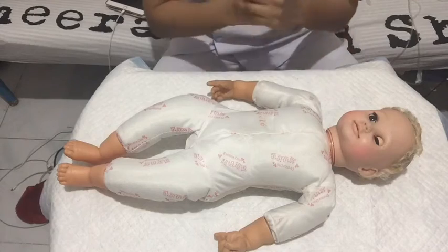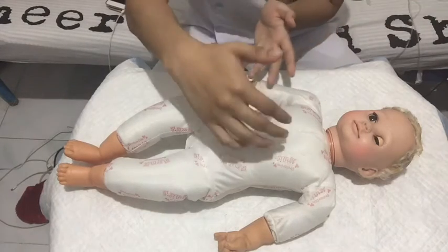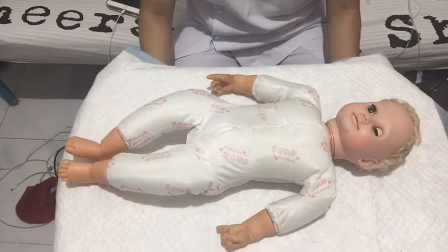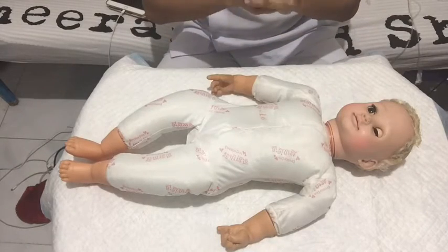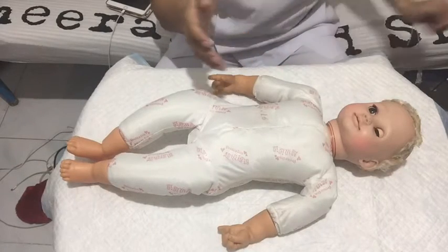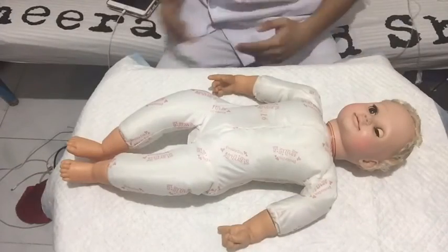Now, before starting, we should always remember to perform a baseline respiratory assessment. We're going to be checking if the baby can breathe well, if the chest goes up, and if they can breathe normally. Then we're going to have to position the patient. The purpose of positioning is that when we remove whatever secretions are inside, it will be easier for the baby. Next, we're going to use proper hand washing technique and get the important things that are needed.